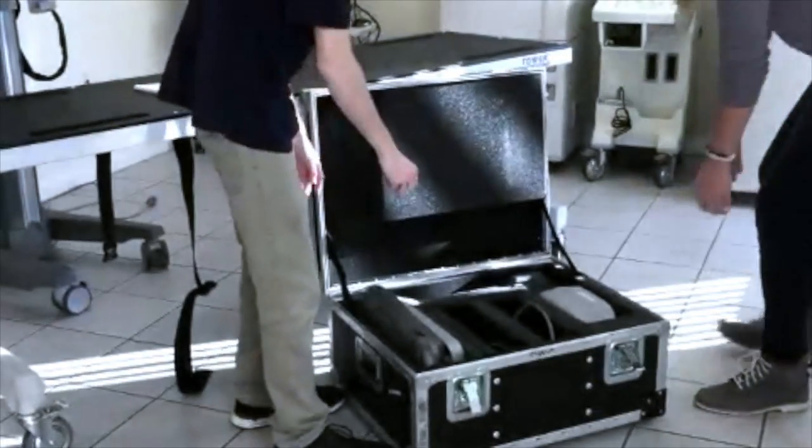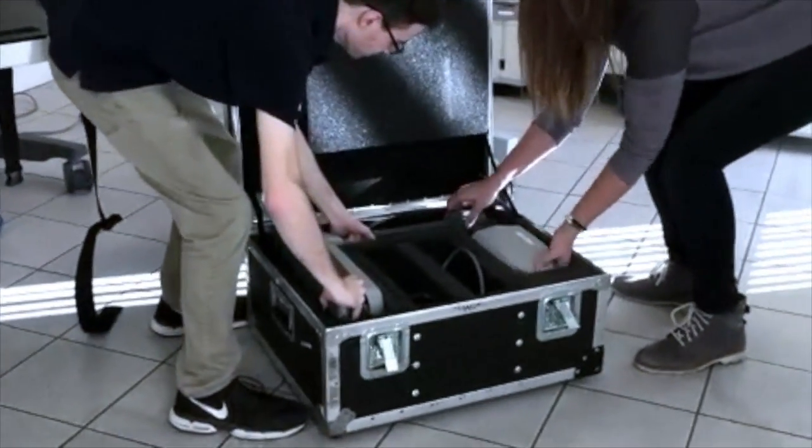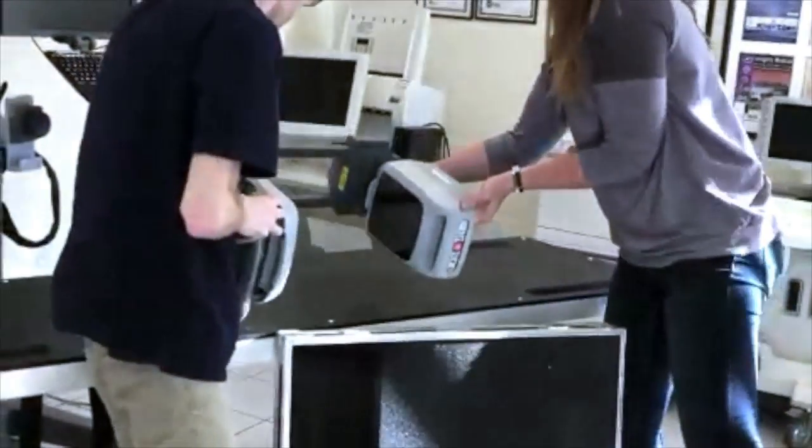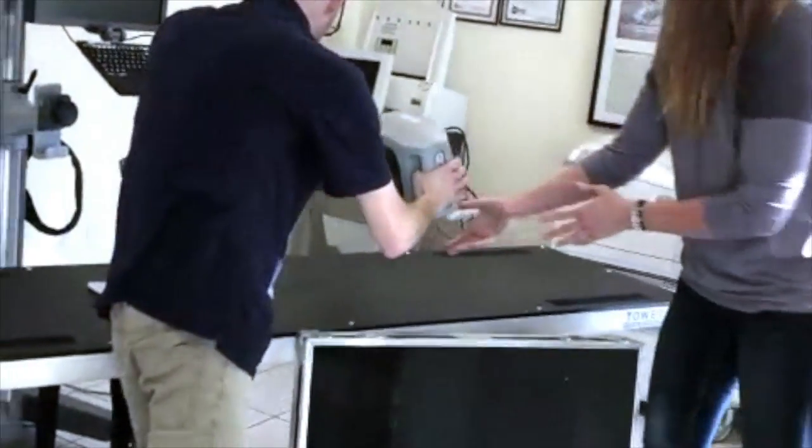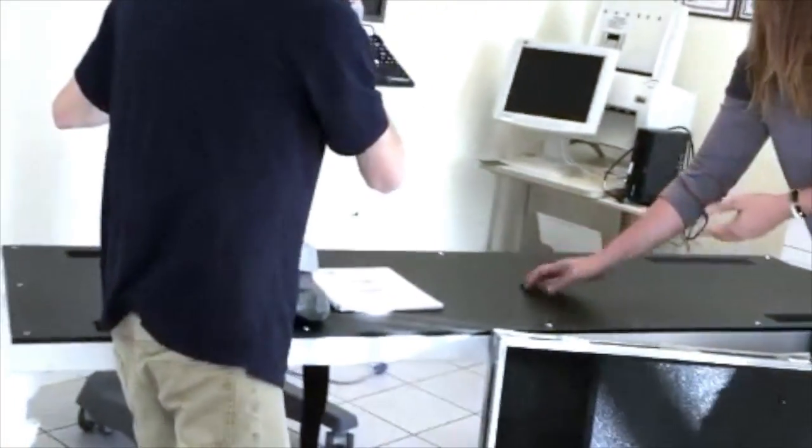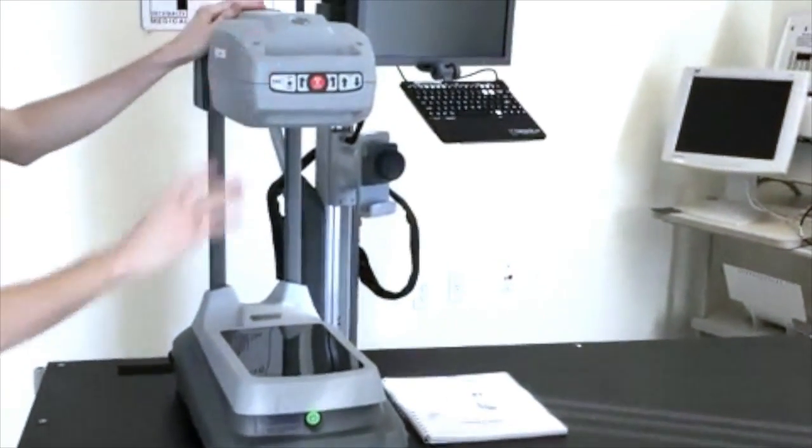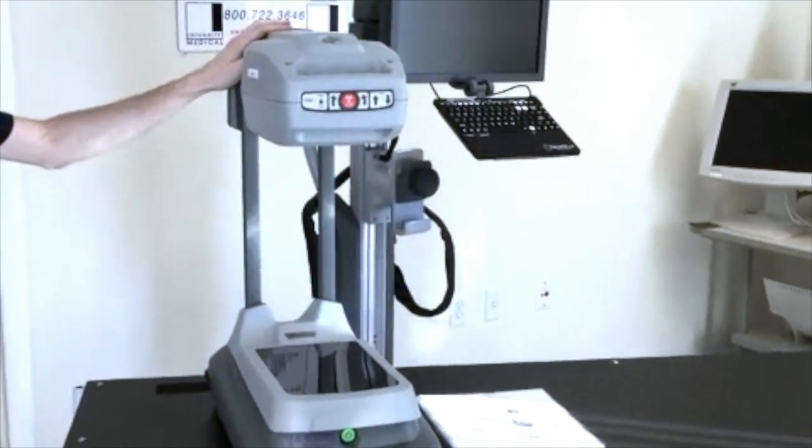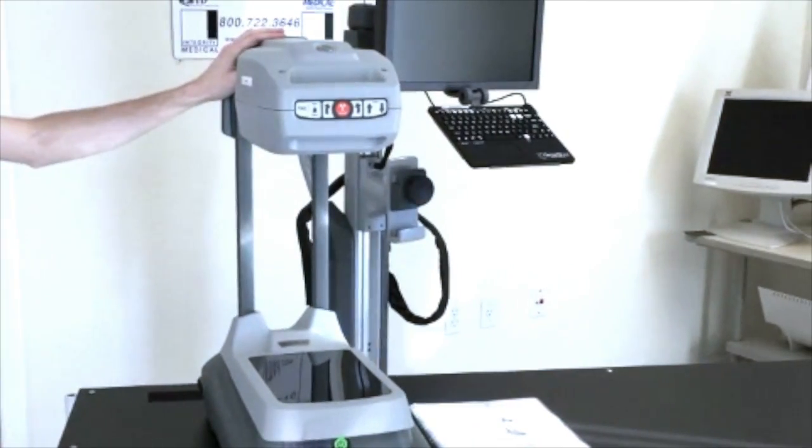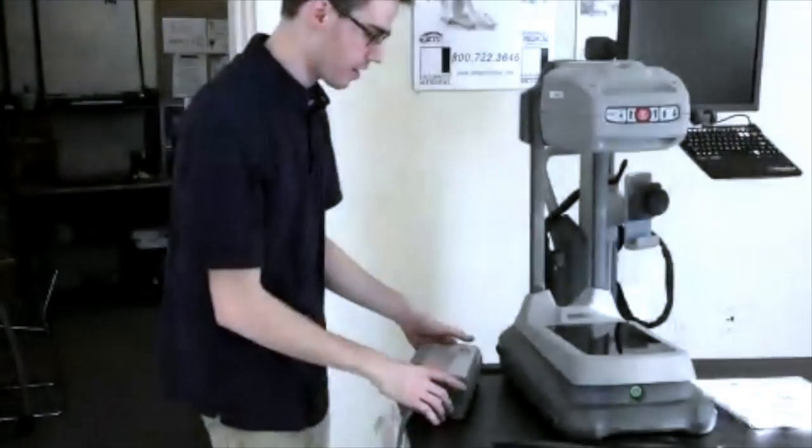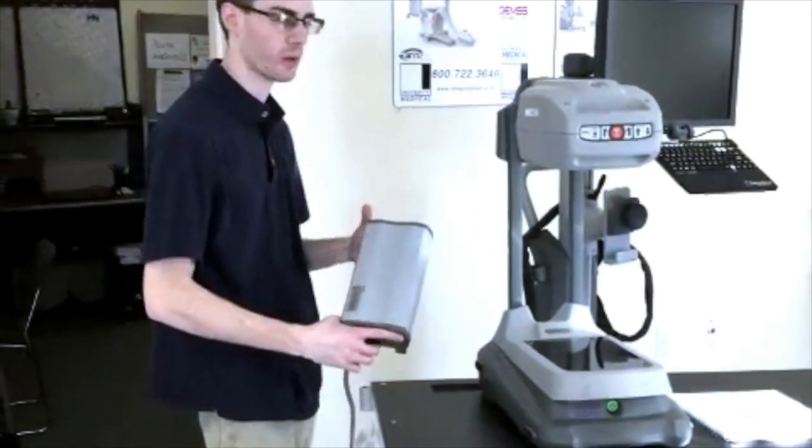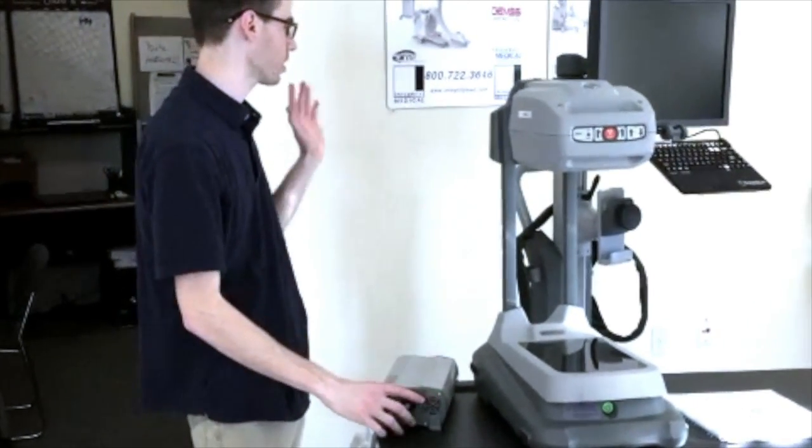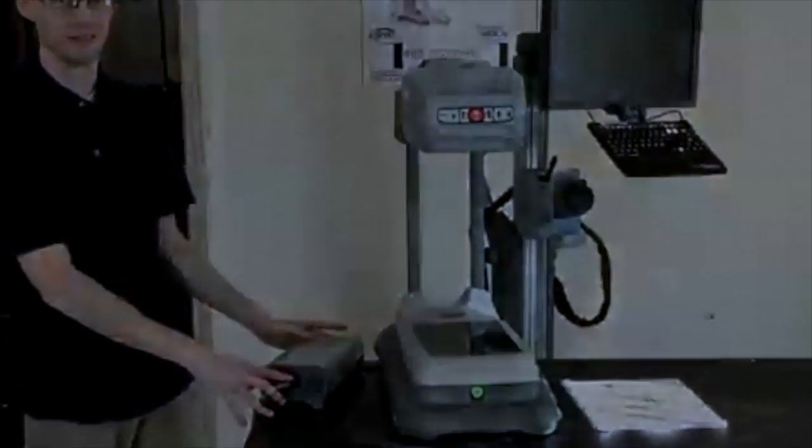Chelsea here is going to help me take it out of the box. We are going to connect the wires to it and show you how to properly hook it up. This is the power supply to the Mobile C-Arm. We are going to mount it to the optional stand here and show you how to properly use it.